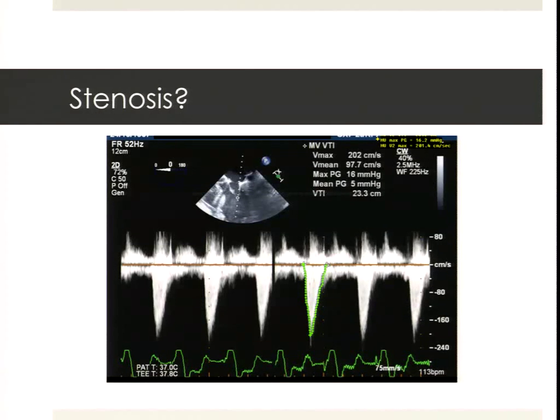You've got to remember the Bernoulli equation changes when you move from a normal crit down to a hemodiluted one. You've got to do 2V squared rather than 4V squared. But the computer will tell you just 4V squared because it's only used to doing that sort of stuff. It doesn't think the patient's got a hemoglobin of 65.